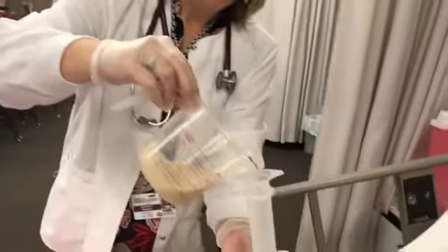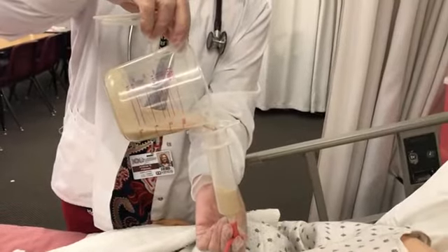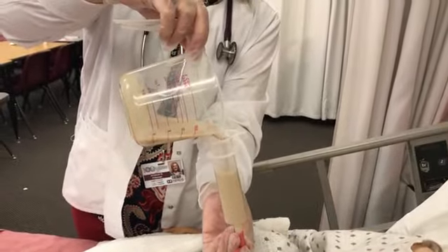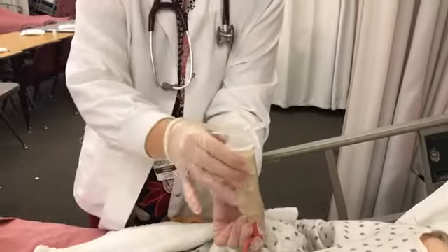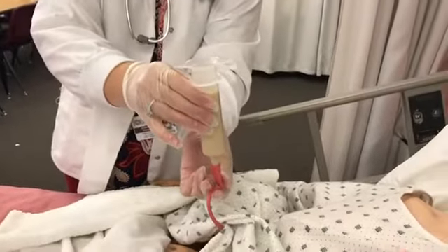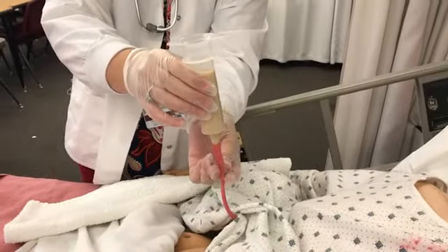Now we will slowly pour this, and we're giving this as a bolus to gravity because our feeding is not on a pump. Depending on the size of our syringe, we'll just let this go in slowly, and we'll catch it before it empties.